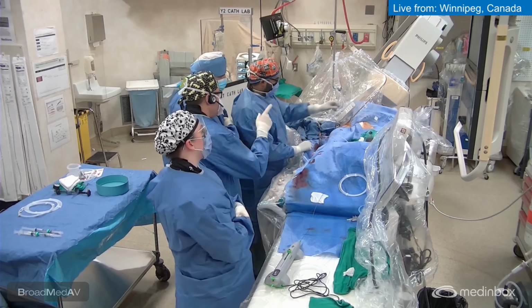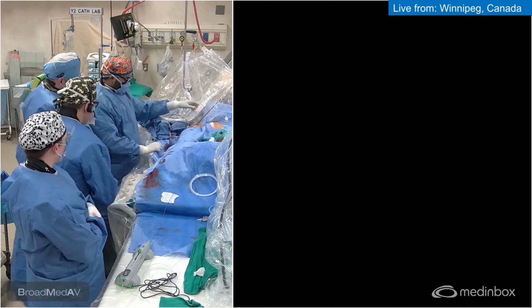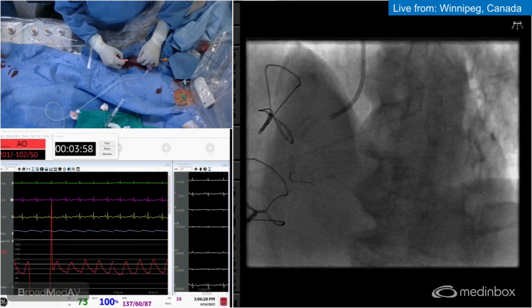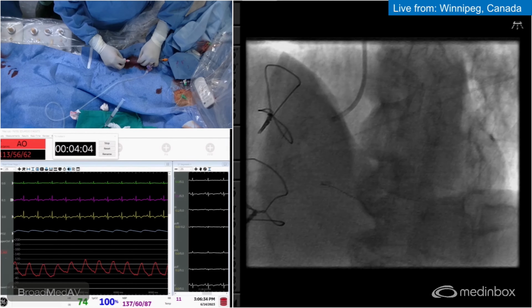We have a 6-French catheter in the vein. We have a 7-French hockey stick guide, and you can see our hemodynamics are stable. Heparin's been given, and we're ready to wire the vessel. So there's a PDA lesion that we're not planning on ablating. Our focus is going to be on the mid-RCA. You can see there the wire has gone down the PDA branch.